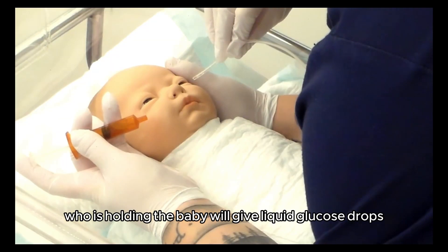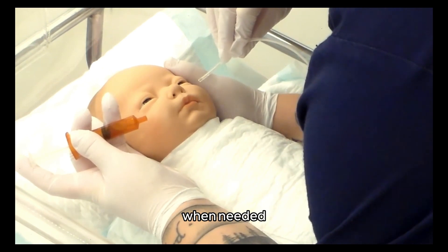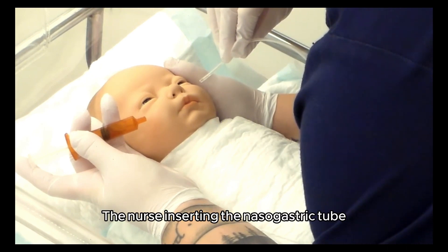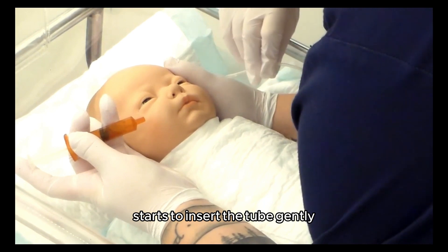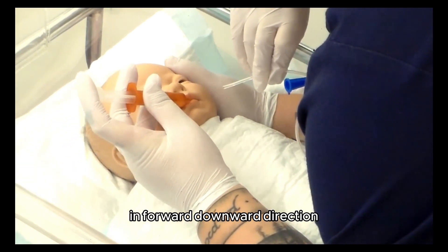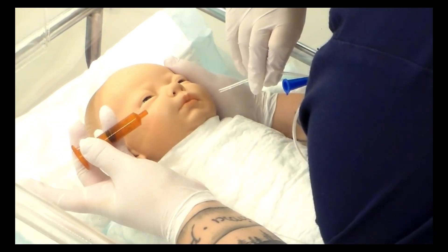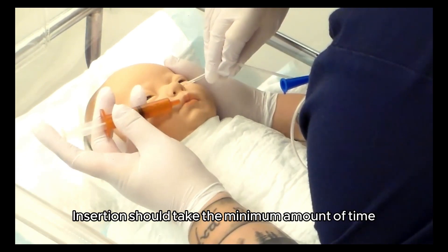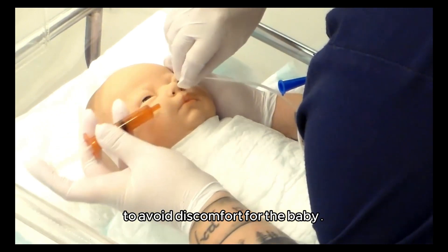The assisting nurse who is holding the baby will give liquid glucose drops when needed during the procedure. The nurse inserting the nasogastric tube starts to insert the tube gently but in a determined manner in a forward downward direction until the marking on the tube reaches the nostrils. Insertion should take the minimum amount of time to avoid discomfort for the baby.